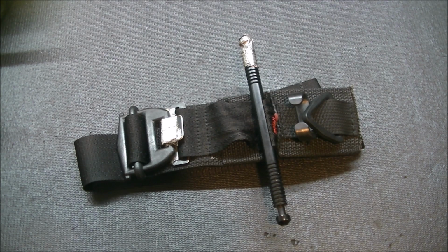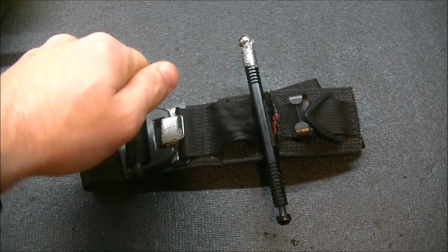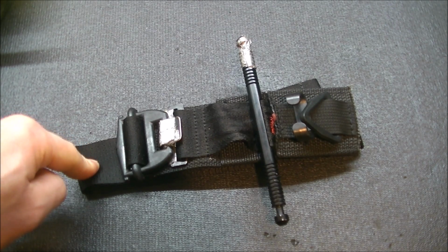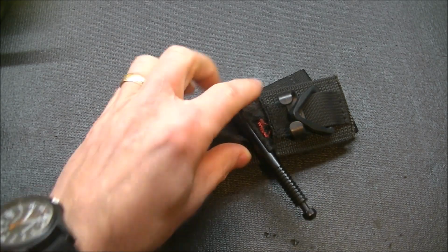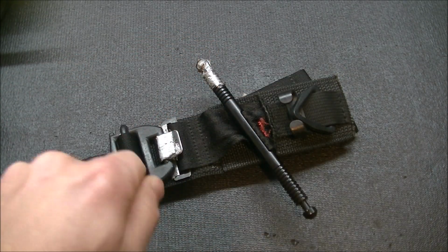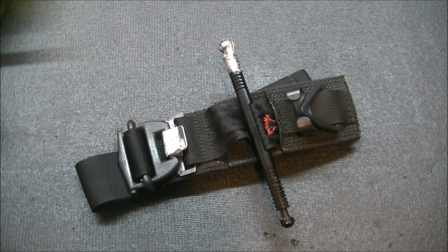And I've had instances where I've done self-application and it was actually just faster for me to loop the excess strap around the end to counter this thing trying to undo itself, and then go around the other end and counter that piece and just hold it in place with the remaining strap. And that was the way I was able to keep circulation cut off. But if you're to use this on another person, it wouldn't be a problem. You could just crank through it and deal with it, use leverage, whatever you need to do. But self-application, it's a bit of a problem.